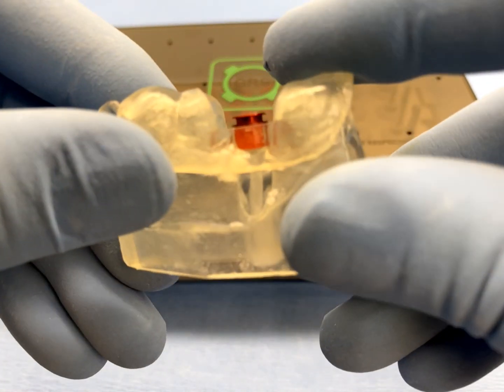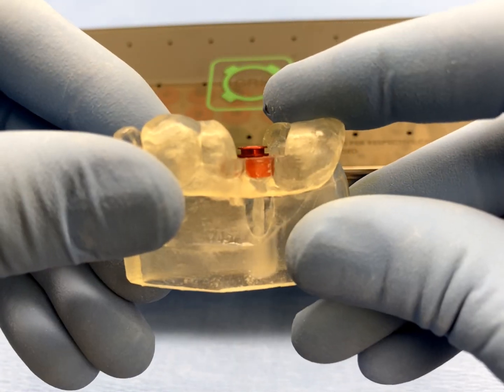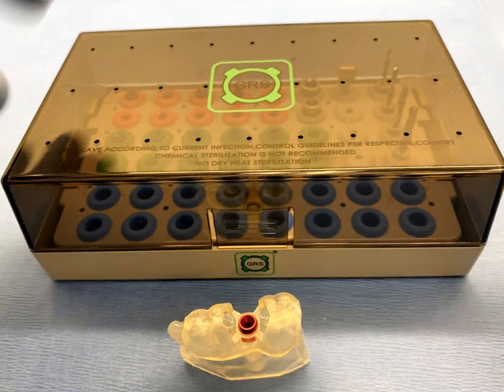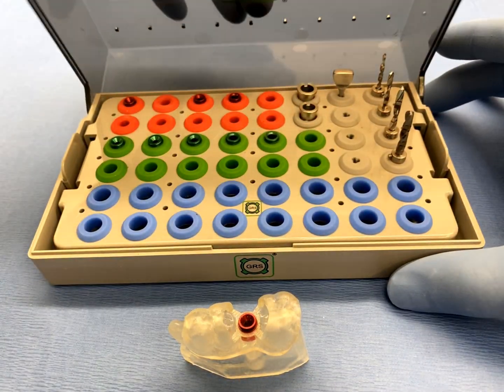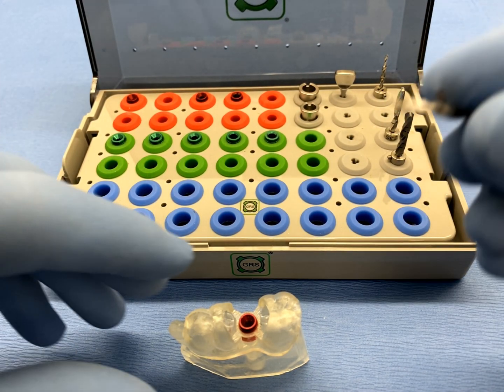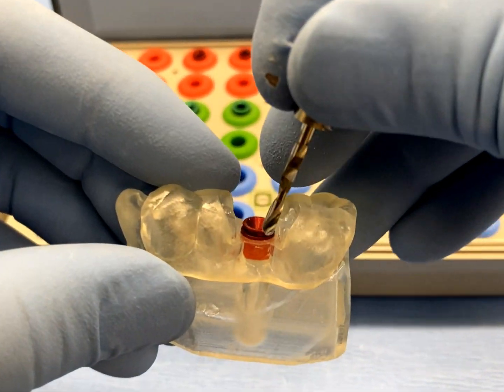After verifying that the GRS surgical sleeve has been seated completely, simply insert the initial pilot drill with a loose fitting drill stop through the GRS surgical sleeve until it reaches the bottom of the hole in the 3D printed model.